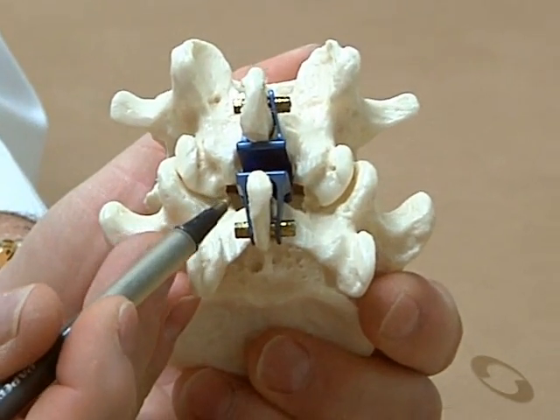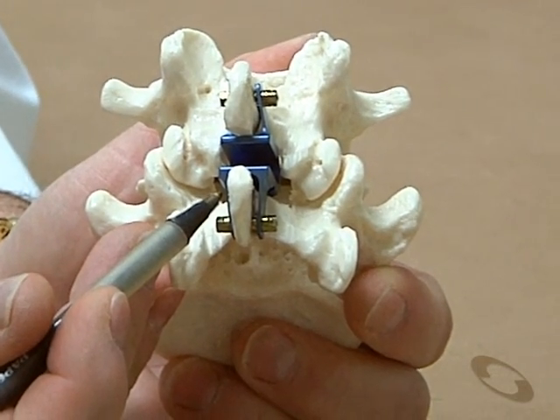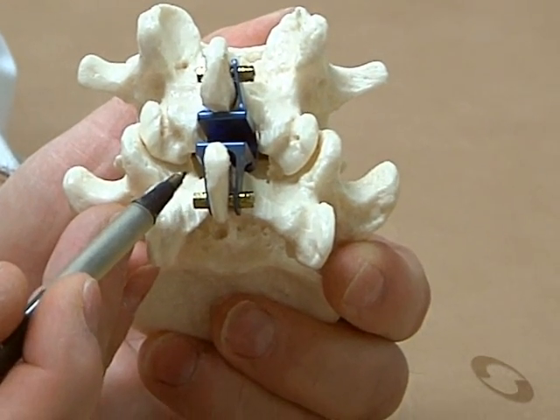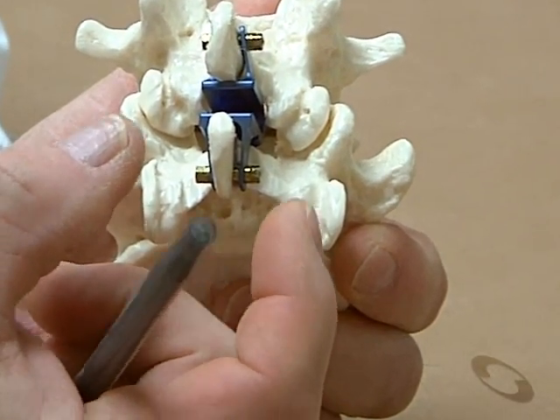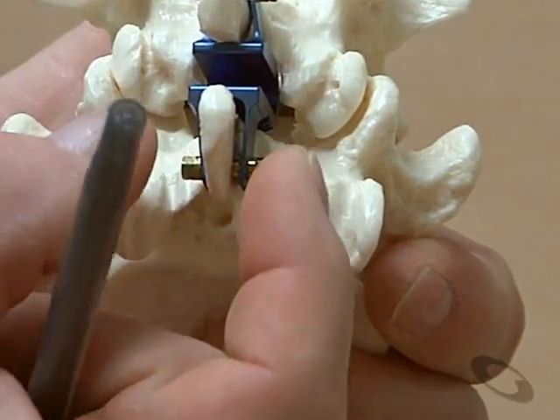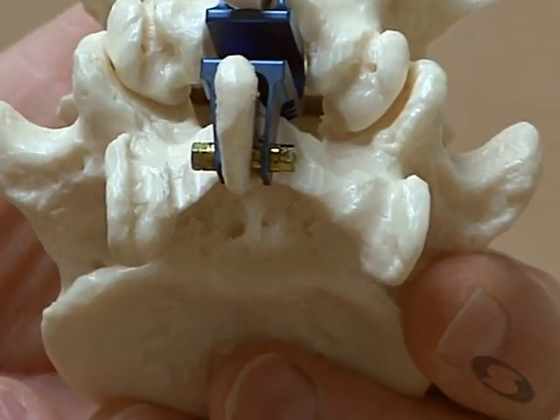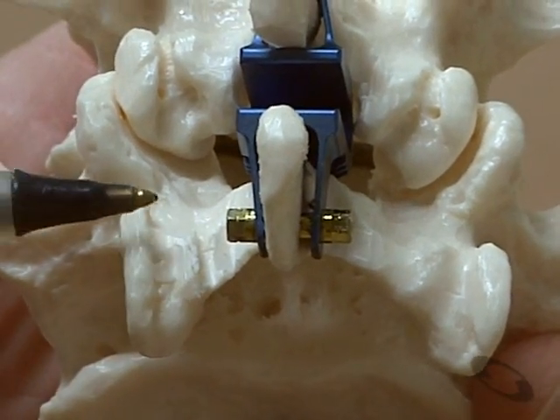These wings that attach to the spinous processes will be splayed open, and then on both the top and the bottom we'll splay them open, we'll insert the implant, we'll close them back down, and then we'll use a punch to make a hole where this rivet or screw goes through.